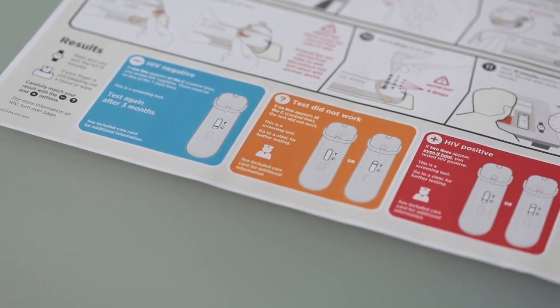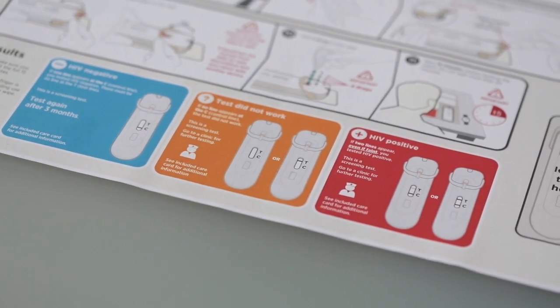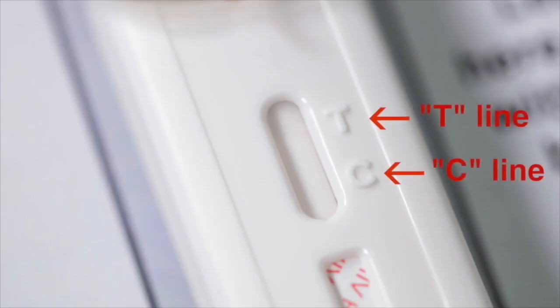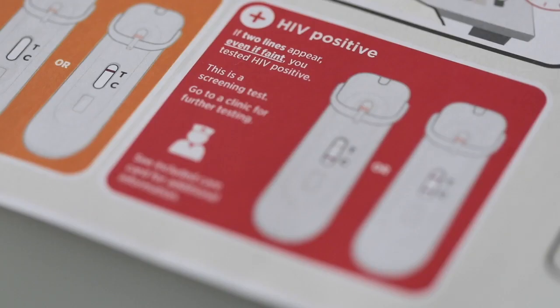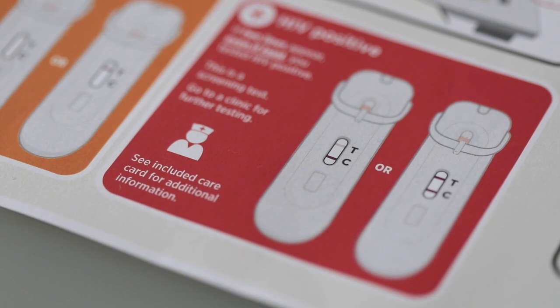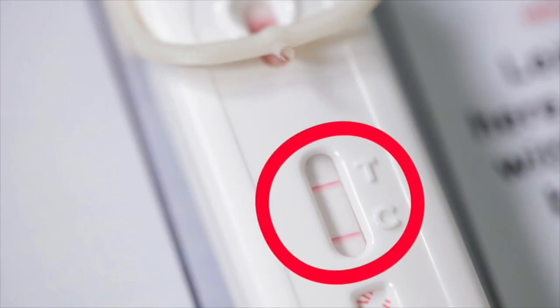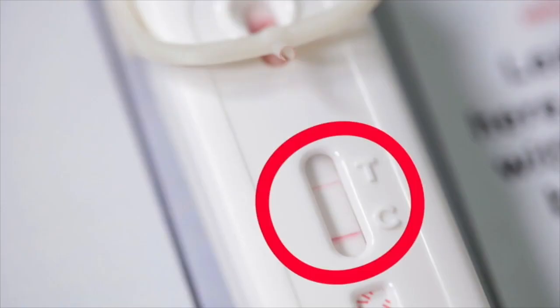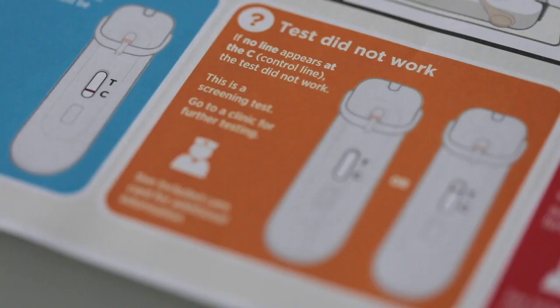Now match the lines in the results area of the test with the boxes on the instructions. It is the lines next to the C and the T which tell you your results. Look in the box labelled HIV positive. If a line appears next to the C and a line also appears next to the T, you have tested HIV positive. Even if the line next to the T is faint, because this is a screening test, it is important that you go to a clinic for further testing to confirm the result.